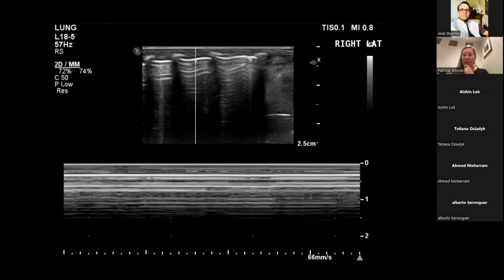Right, so really easy, yeah? In reality, no, it's not. And I want you to have a healthy respect that sometimes this isn't as pure as you'd like it to be. Of course, when baby's incredibly sick, it is easier. But when you're stood at the end of the bed looking hard, going, maybe it does fit, but maybe, let's see. But if what, so what? You have to bring this back down into clinical context.